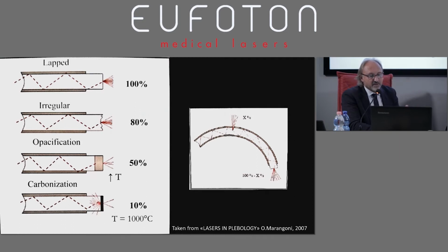So it's not just that it doesn't work so well. No, maybe it gives more harm than good. So we have to bear this in mind. Opacification also belongs to wear and tear, and also carbonization, the same.